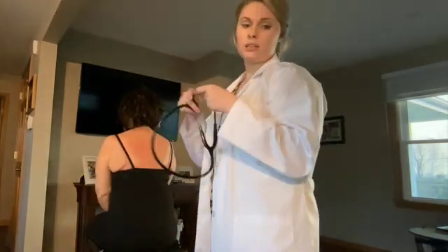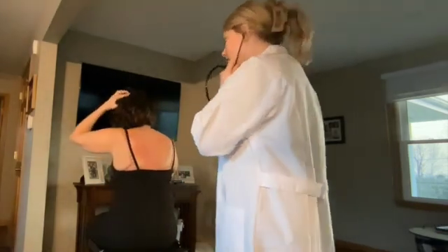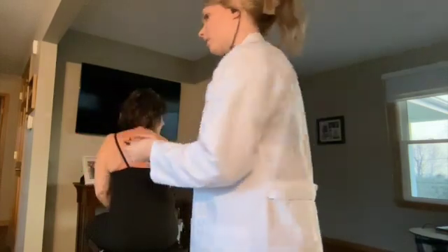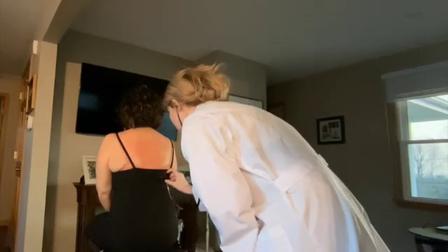All right, now I am going to take a listen to your lungs posteriorly and laterally using the diaphragm. Just take a big deep breath for me. And out. And again.